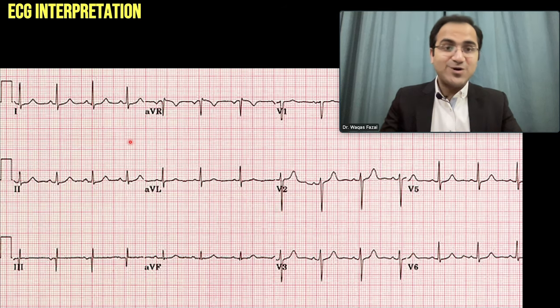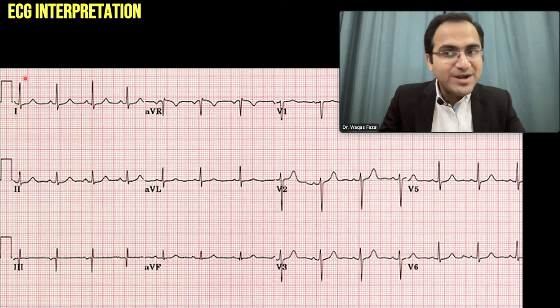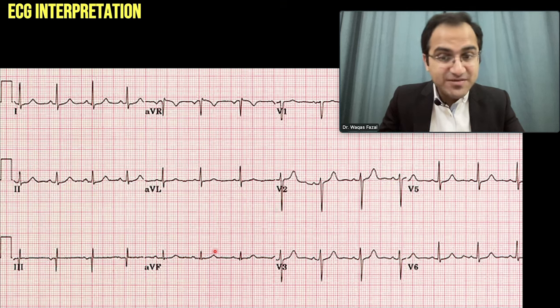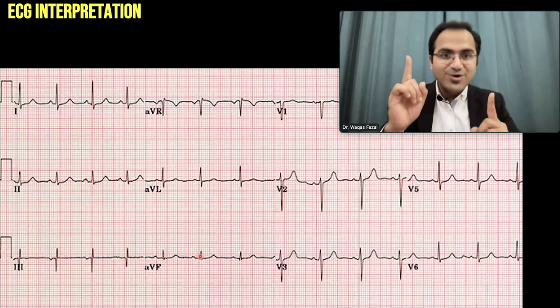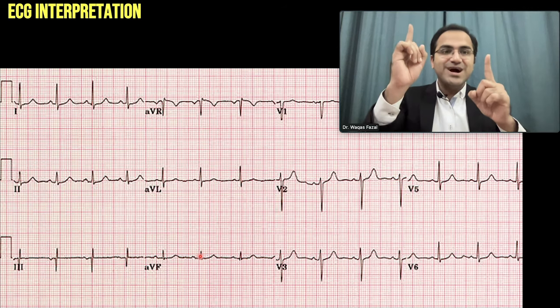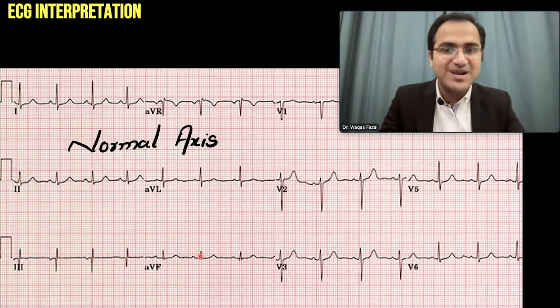Now let's solve some ECGs. Looking at Lead I — it is pointing upward. Looking at Lead aVF — aVF is also pointing upward. Both are pointing upward, so it is a normal axis.